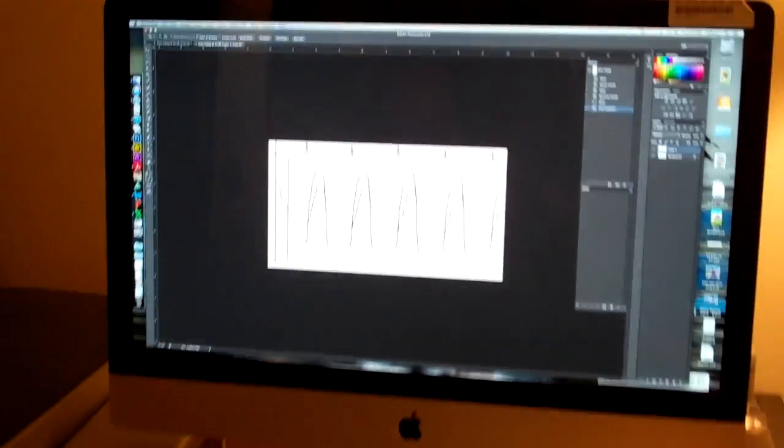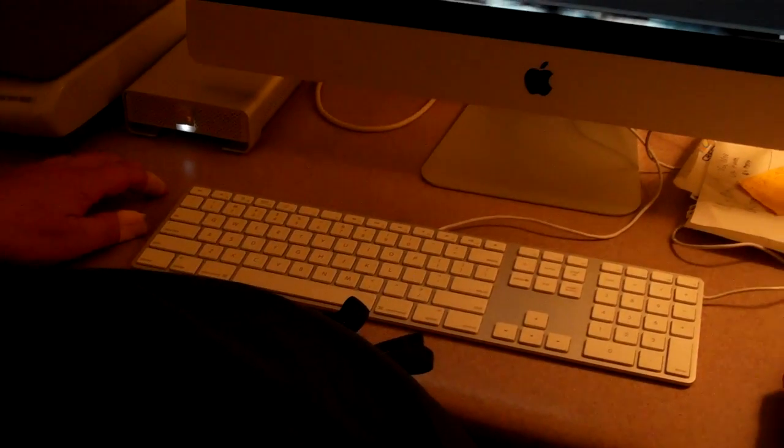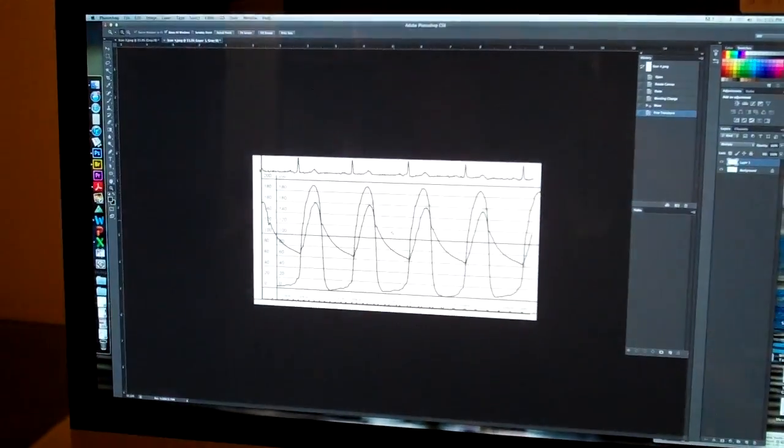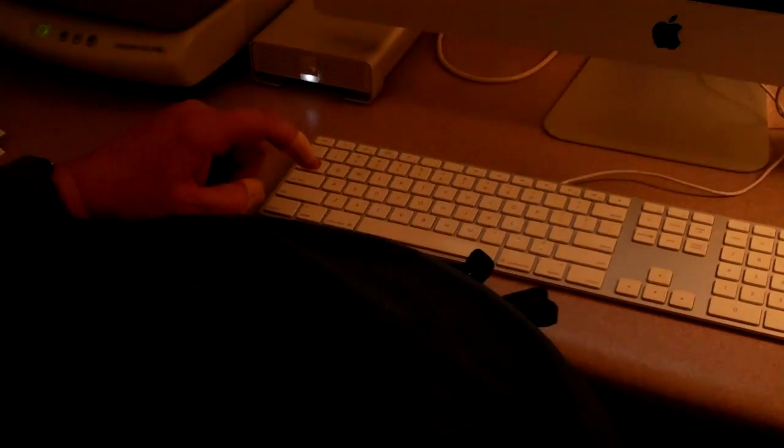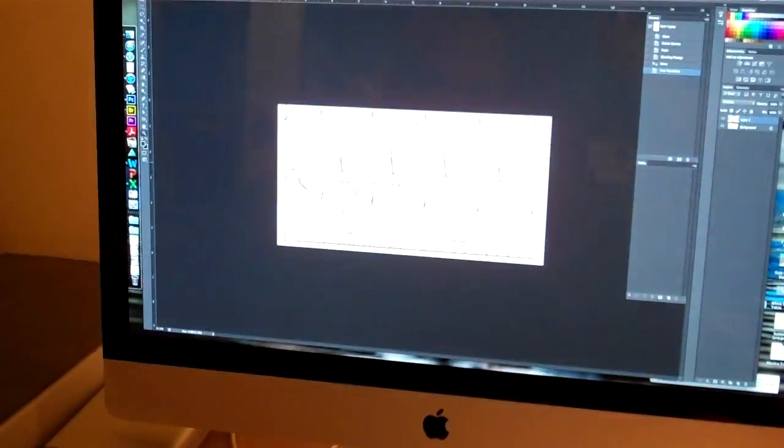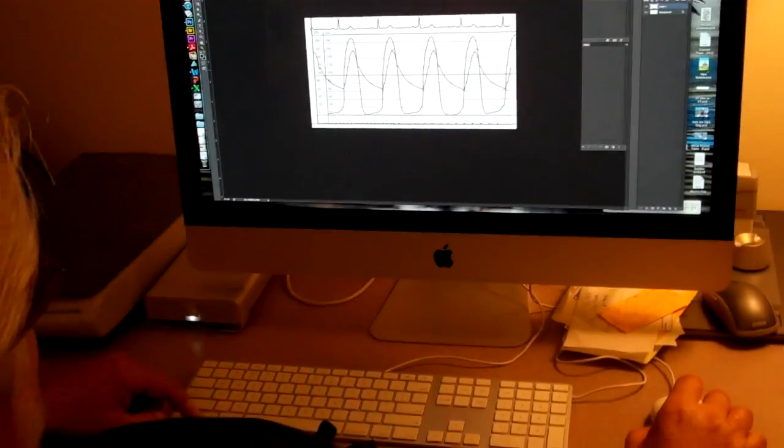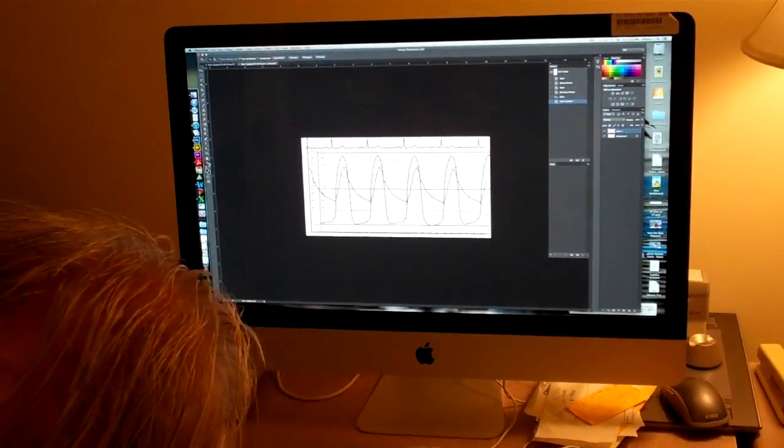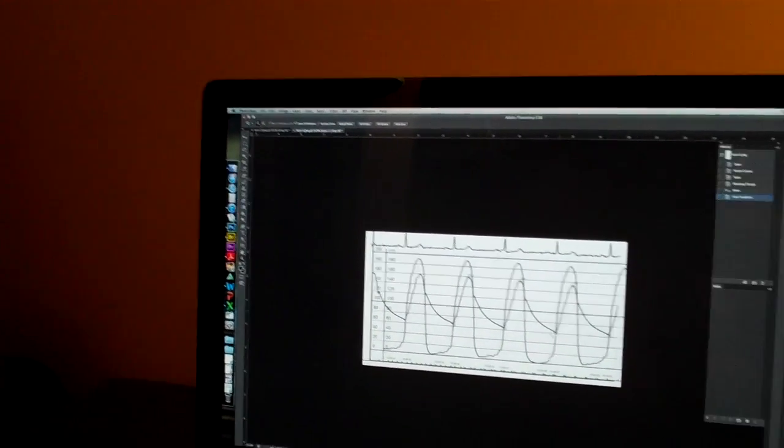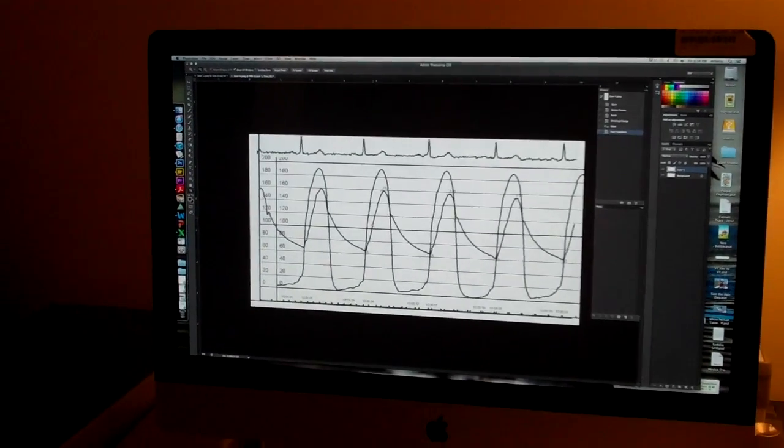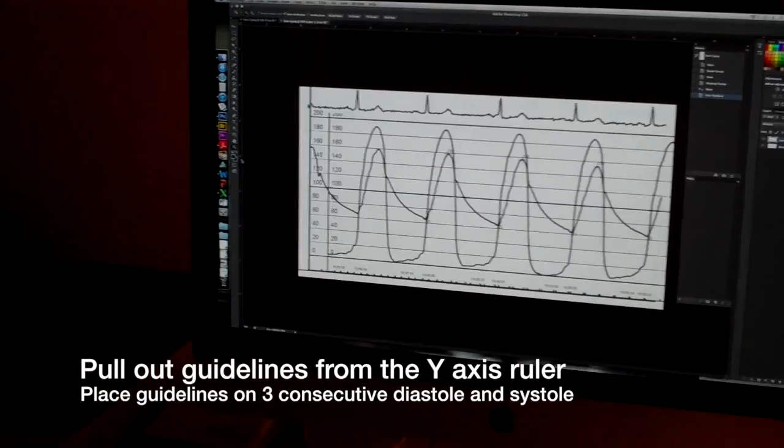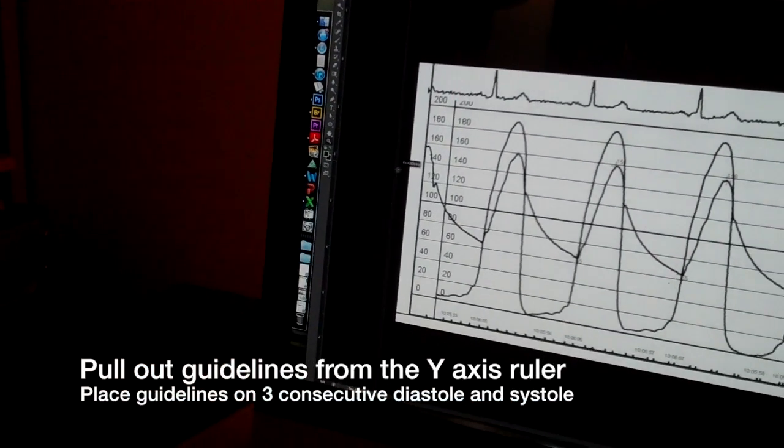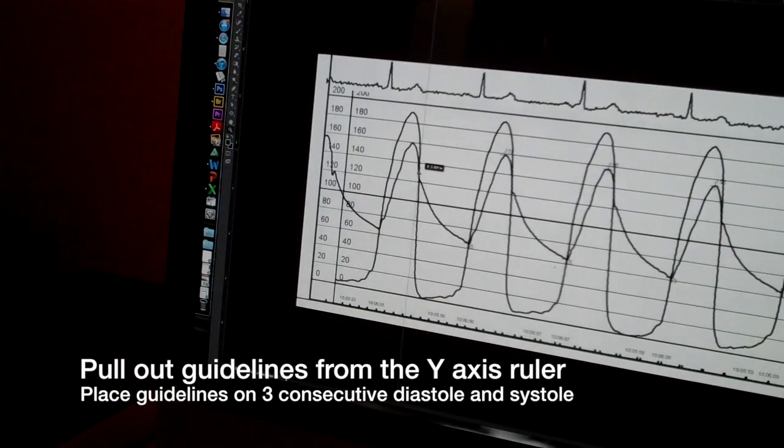I can enlarge these tracings by going to the Z key on the keyboard, and that gives me the magnifying glass. And I can click on this to enlarge. Holding down the option key at the same time lets me make things smaller with this tool selected. So now I'm going to want to pull out some guides. And what I do is go over here to the ruler on the left and pull out. I have to pick three beats starting with a diastole.